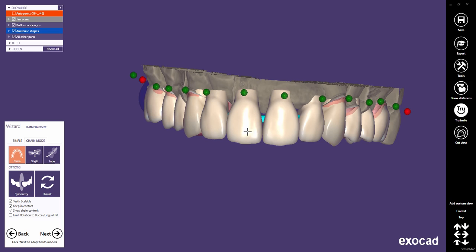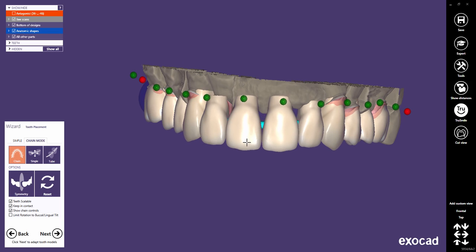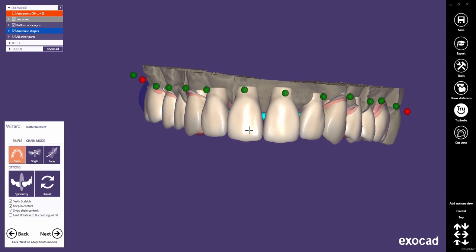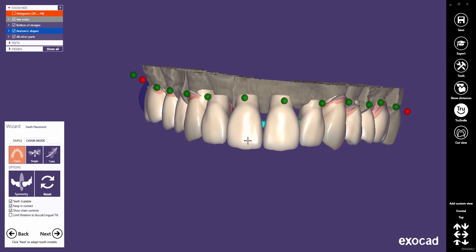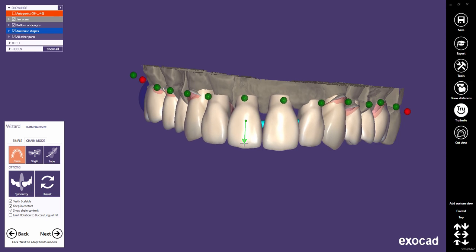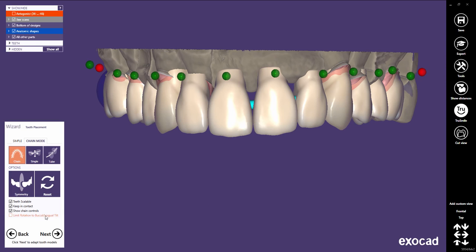In chain mode, the greater the distance to the tooth you move or rotate, the less it influences the adjacents. If the chain's ends are pinned, scaling only affects one tooth's size, but the adjacent's position may change as they remain in contact.